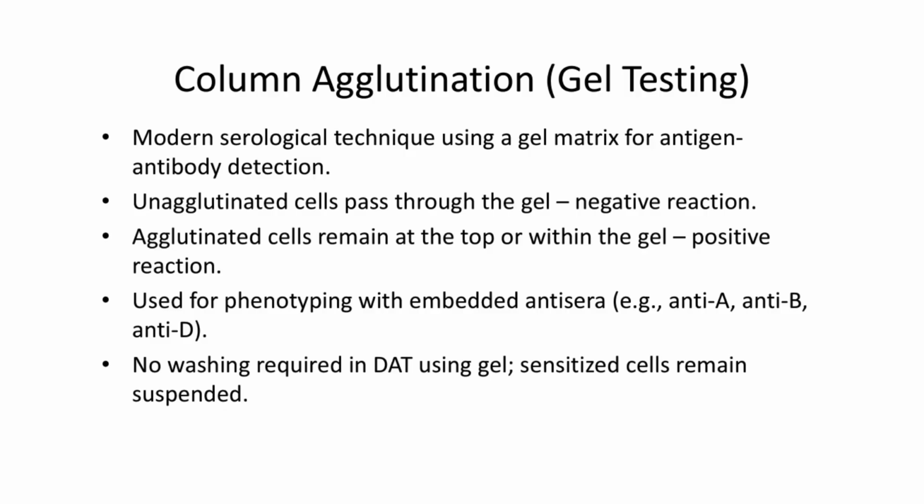For direct antiglobulin testing, DAT, using gel technology, washing steps are not required. Only unsensitized red blood cells will pass through the gel, while sensitized cells will agglutinate when they encounter anti-IgG in the gel, remaining suspended or trapped within the column.